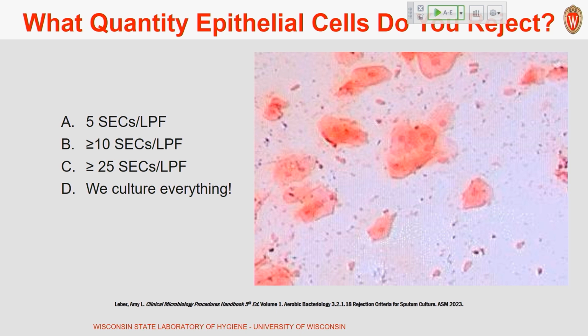I'm sorry, did you say mucus present for the Q score? Yeah, we evaluate it on the gram stain, and usually you can see the threads on the gram stain.